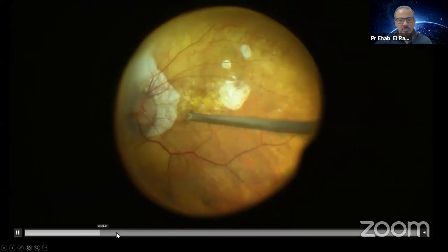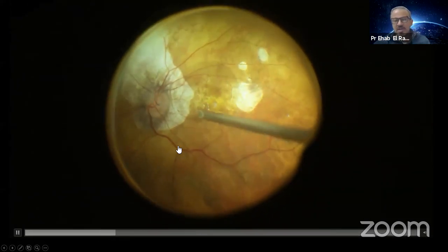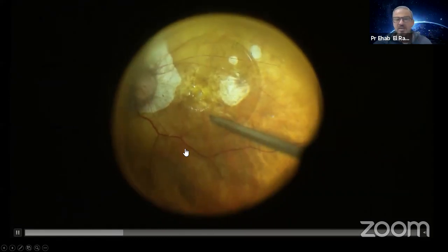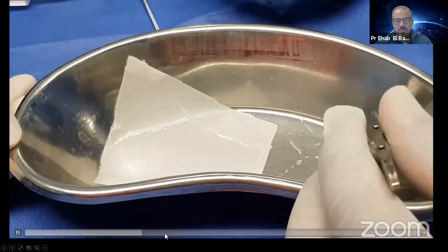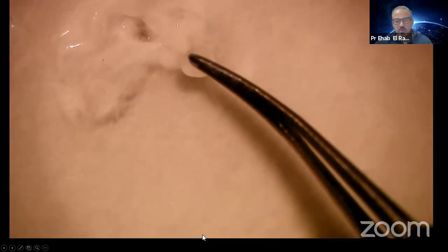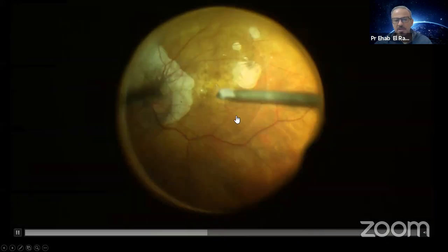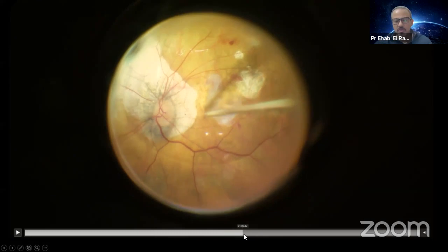We put the amniotic membrane under perfluorocarbon, which is the best way to manipulate it inside the eye. If you do it in fluid-filled eyes, they're likely to move around. So just putting the perfluorocarbon bubble first, preparing the amniotic membrane there with the punch, and small piece inside the eye, aspirating and injecting it directly in the perfluorocarbon bubble over the hole right there.